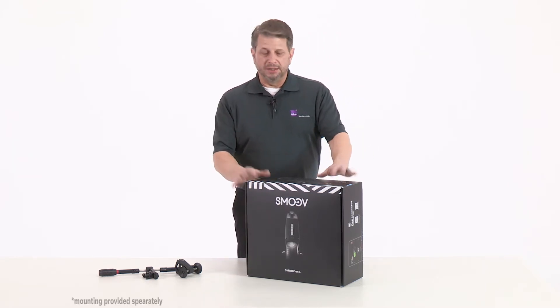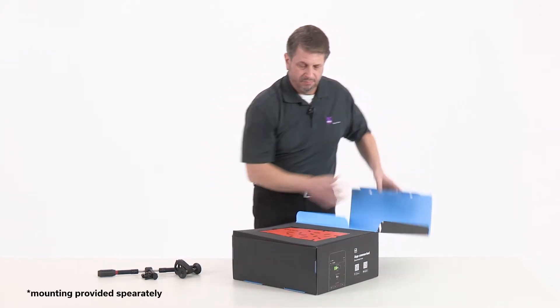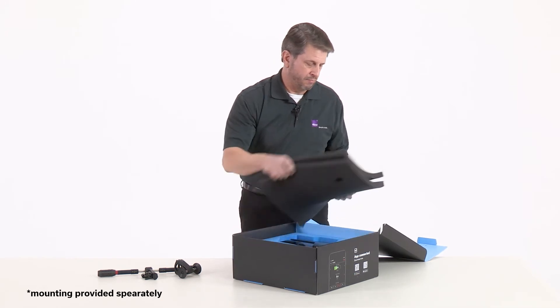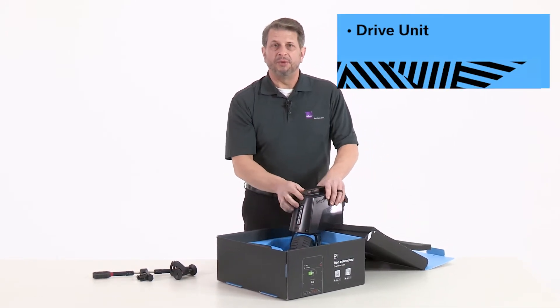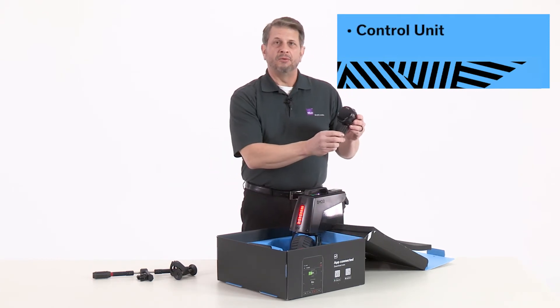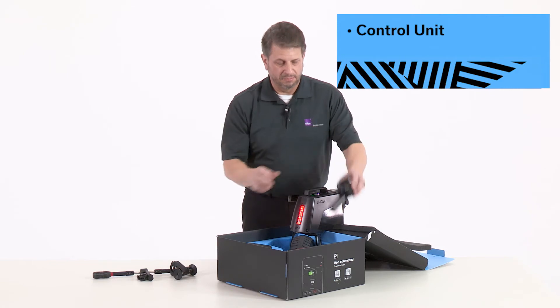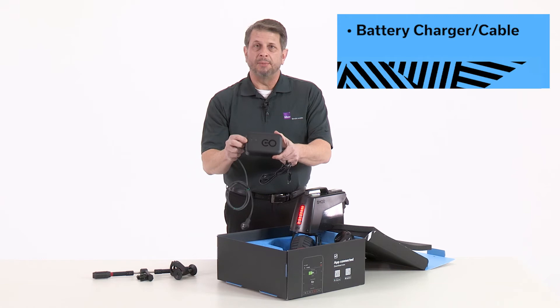Everything you will need is in the box: the Smoove One drive unit, the Smoove One control unit, and the charger and its cables.